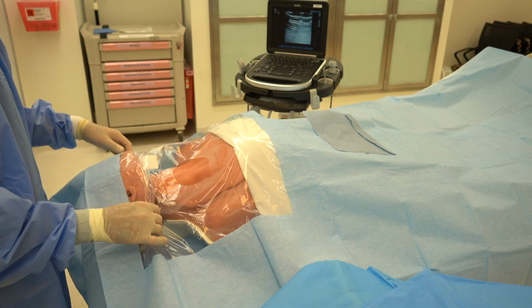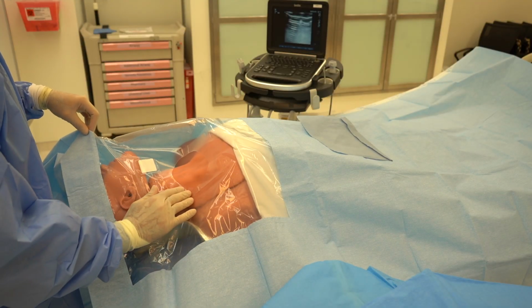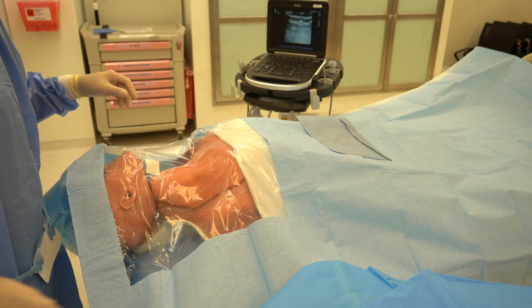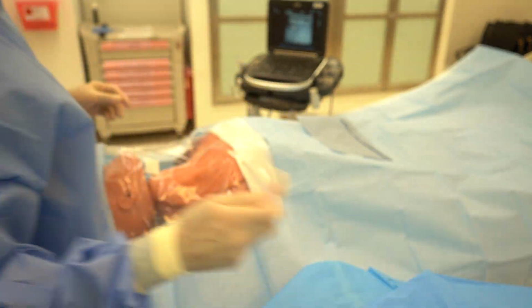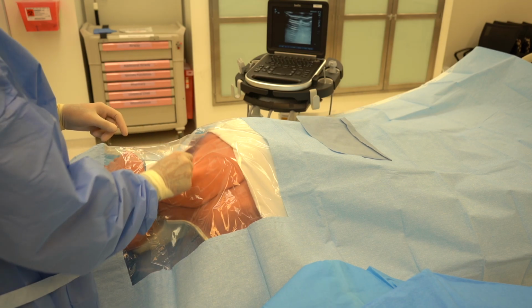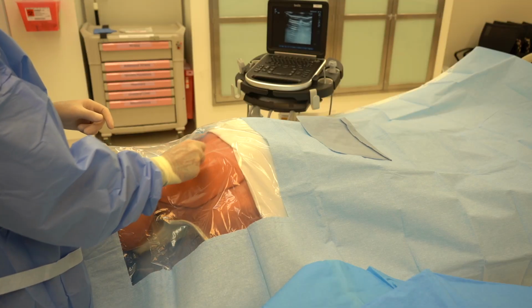Now at this point, we want to make sure that we are over the appropriate site. That's why we clean off a large area. You can see here I'm not making contact with the skin yet. I'm going to sterilize one additional time, and while this takes its 2 to 3 minutes to dry, that'll give me opportunities to get more of my kit set up as needed and get my probe cover set up.